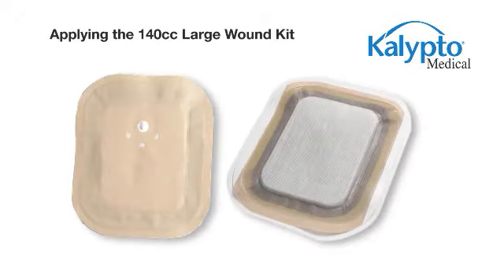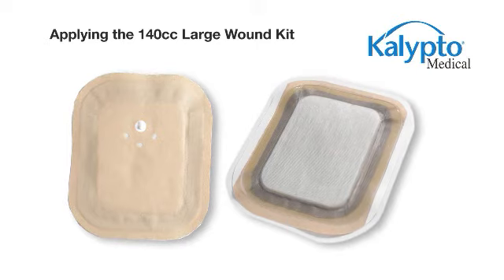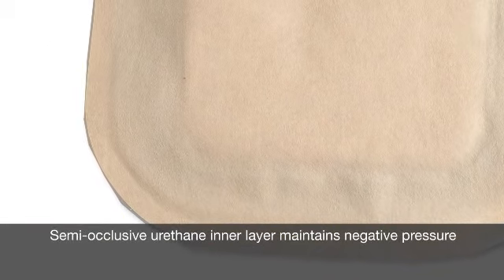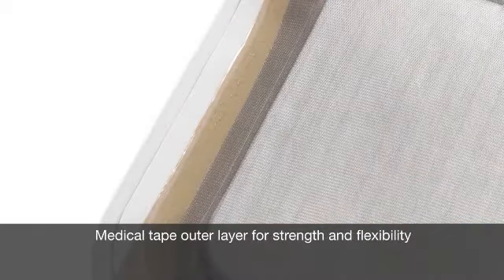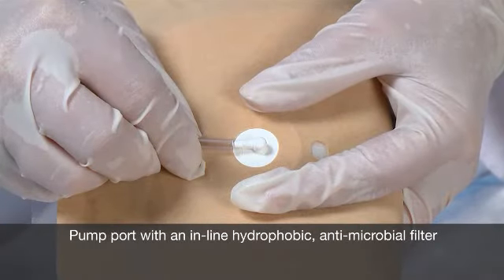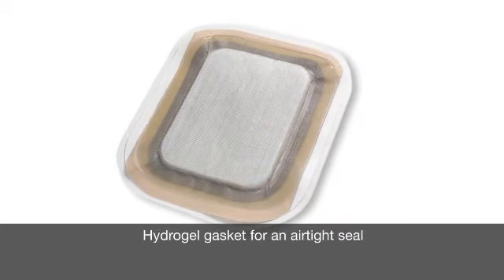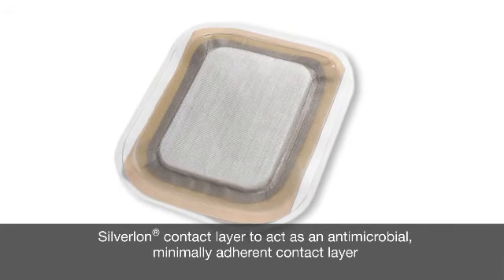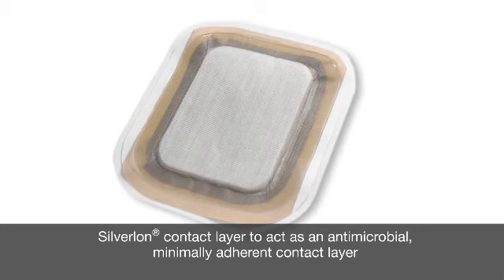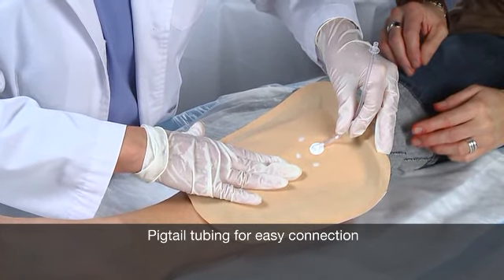Applying the 140cc Large Wound Kit. The Advanced Wound Kit technology from Calypto Medical is designed for use specifically with the NPD-1000 Negative Pressure Wound Therapy System. This proprietary wound kit technology has a semi-occlusive laminate cover with a urethane inner layer to maintain negative pressure, a medical tape outer layer to give the wound kit strength and flexibility, a pump port with an in-line hydrophobic antimicrobial filter, a superabsorbing pad to trap exudate, a hydrogel gasket to provide an airtight seal around the wound, and a minimally adherent Silverlon contact layer to address microbial contamination on the surface of the wound. This wound kit also comes with 6-inch pigtail tubing that attaches to the pump port.